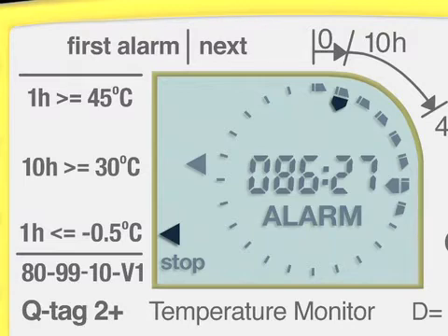The first alarm is shown with a limit indicator at the very left side of the screen. In this example, the first alarm was a -0.5°C alarm for at least a one-hour continuous exposure. The second alarm happened during the seventh 10-hour period of the journey, indicated with an additional arrow next to the seventh dark segment pointing to the middle. The type of this second alarm is shown with a limit indicator pointing to 30°C for at least 10 hours cumulatively. If there is a third alarm, it will be shown under the next sign, but it will not be possible to tell which is the second and which is the third alarm.